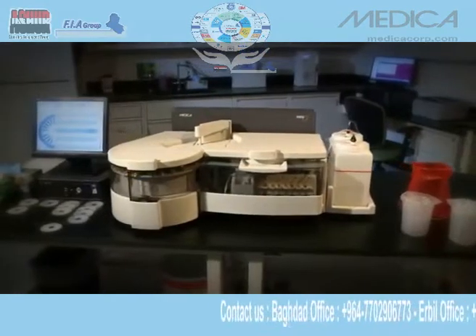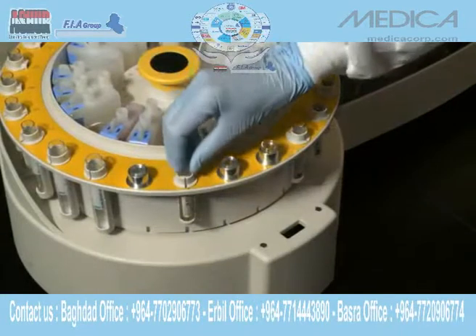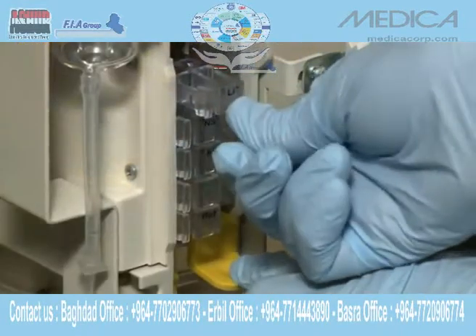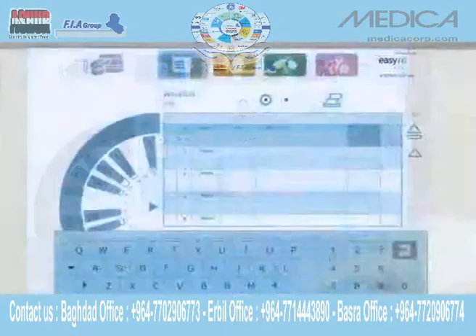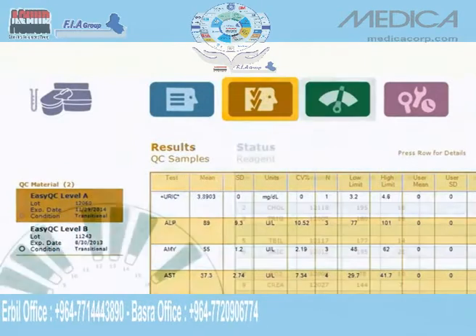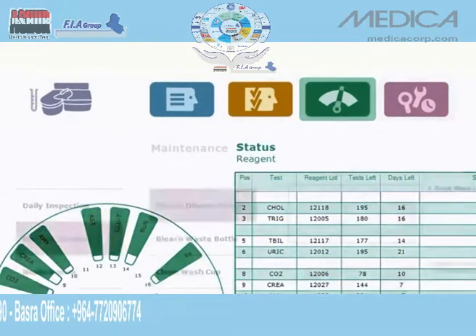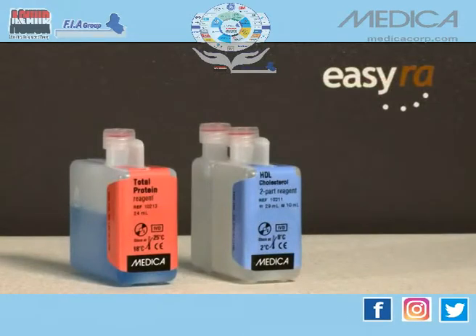EZRA's low-cost modular design is intentionally easy — easy to use, easy to maintain, and easy to learn — because the touchscreen monitor and simple, friendly, icon-driven user interface is similar to those features commonly found in smartphones.